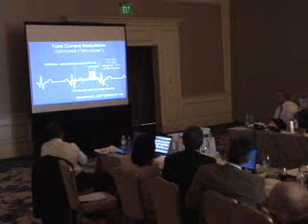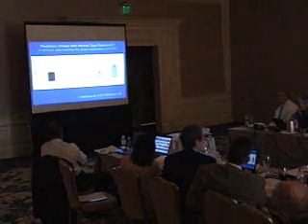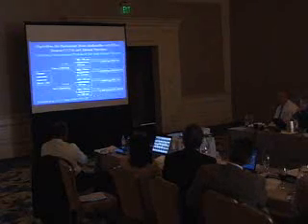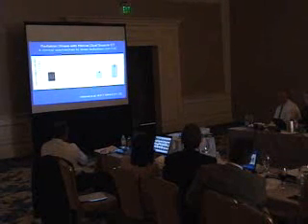This is what one of my fellows, Ariel Getstein, used. We use that approach to tailor. We use the heart rate, the patient's body mass index, and the amount of calcium in their coronary arteries to tailor the procedure to the individual patient.